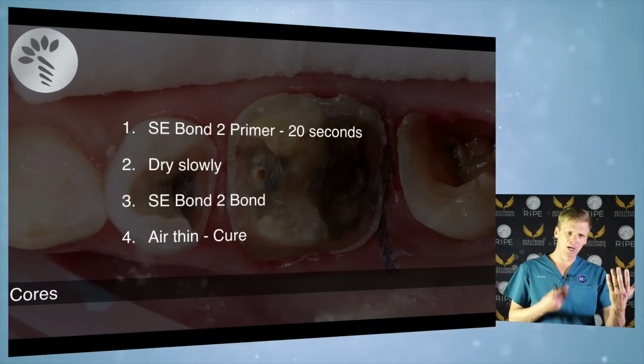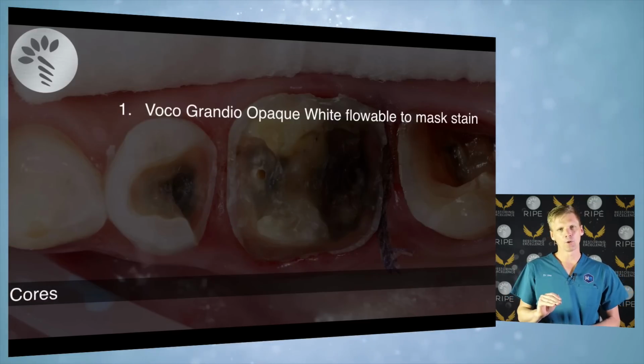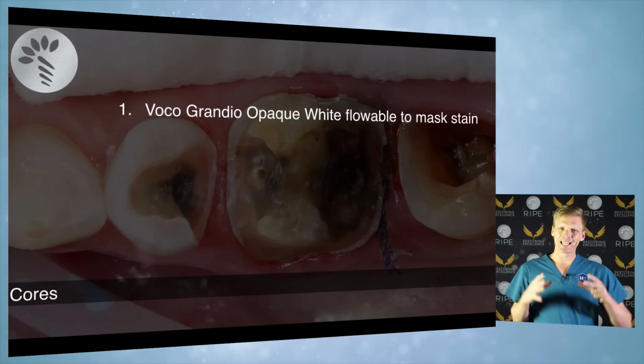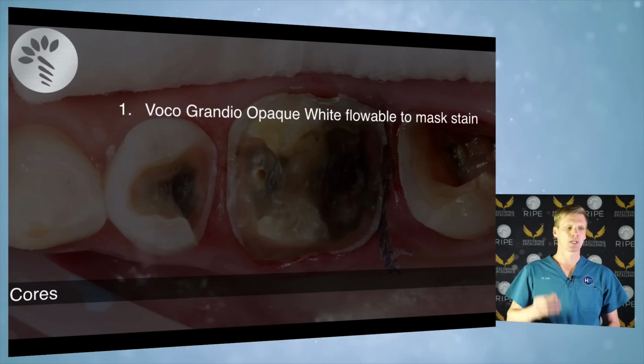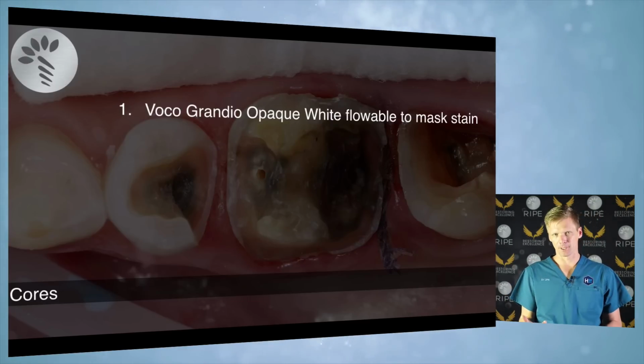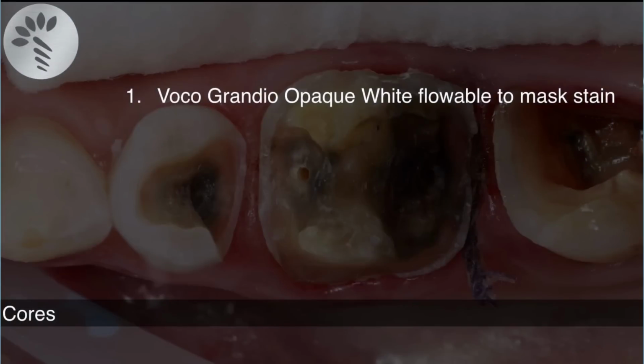Then I cure that, and I use opaque white because often the black stain in your tooth, if you cut all that black stain out, there's often no tooth left. You are going to get a pulp exposure, or you're going to have a very weakened tooth, and there's no need to remove silver oxide.